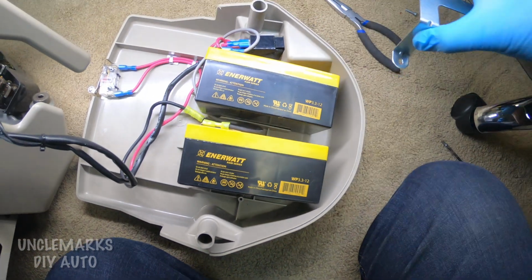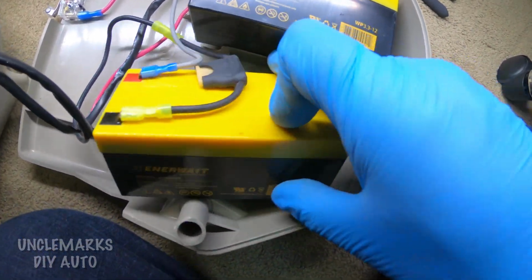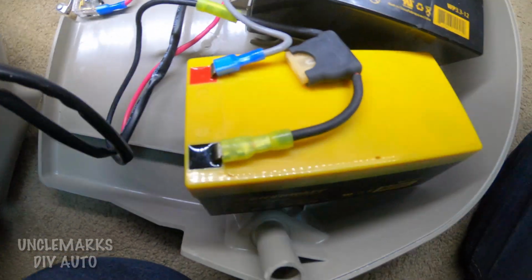Let's get this out of the way. That should be fun putting back in later. And we just have to unhook these. Be good to remember how they're hooked up.